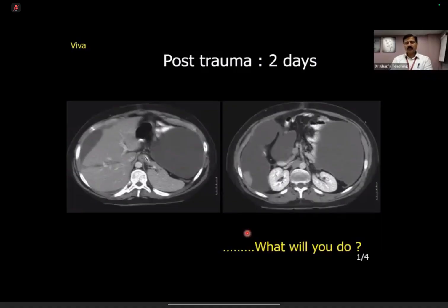The answer is, and this is a classical scenario, it has come in the exam many a time, this kind of a case. You have to keep your minds open about this, biliary leakage, where you just ask the clinicians to tap it, send it to the lab, bile salts and bile pigments, and you got your diagnosis.